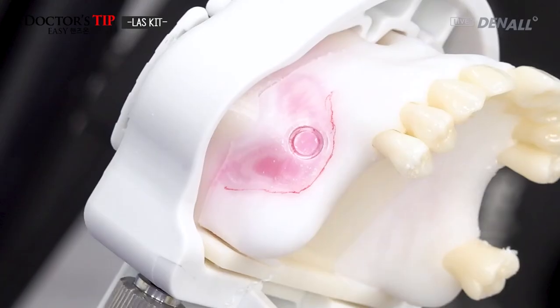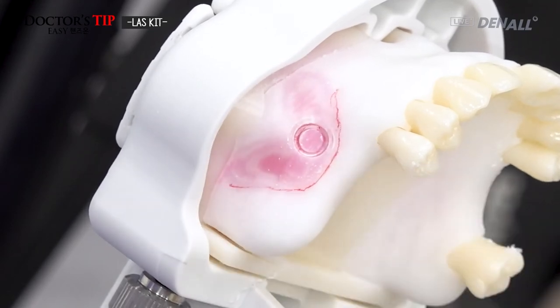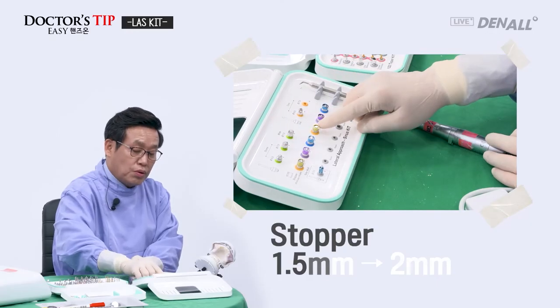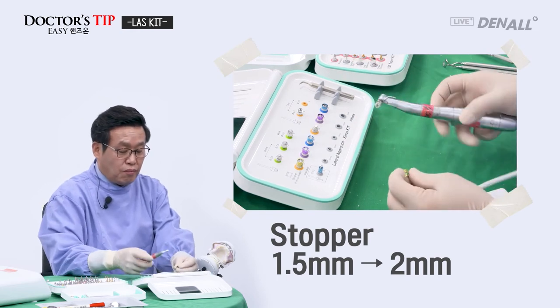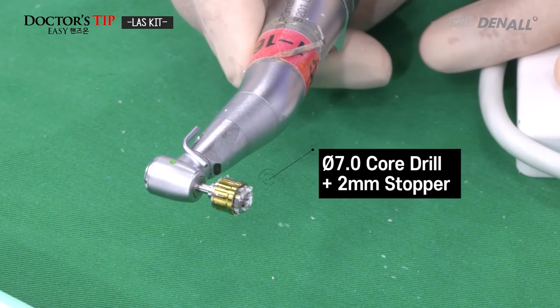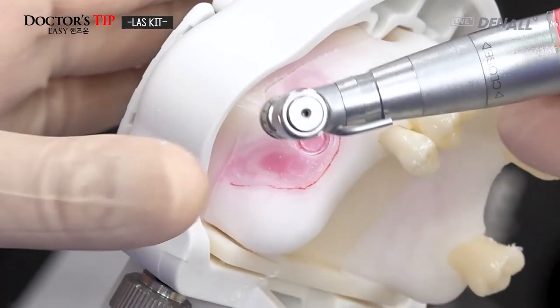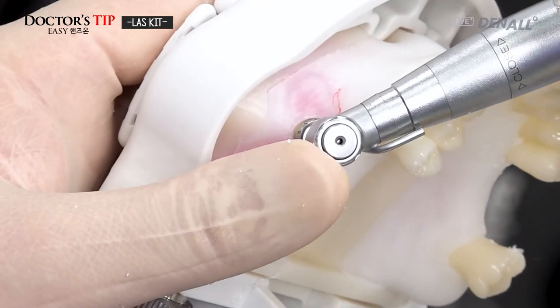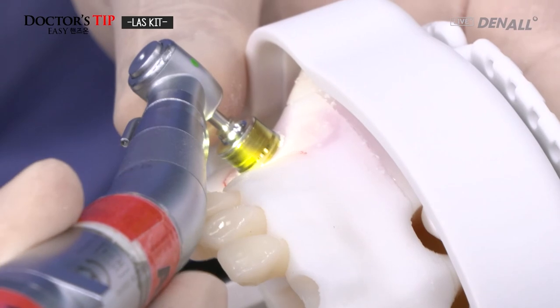And as you can see, the window is still not fully detached. So a 2 millimeter stopper will be used. Like this, the 2 millimeter stopper will be used. And here, the lateral wall is bent, and that's why it's not fully detached. And like this, try to form the window by going in.